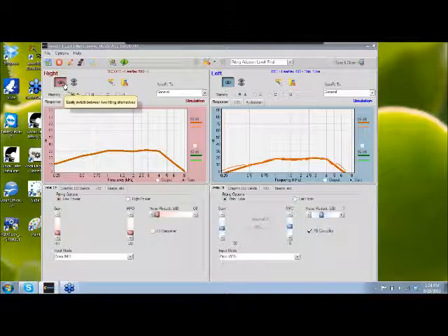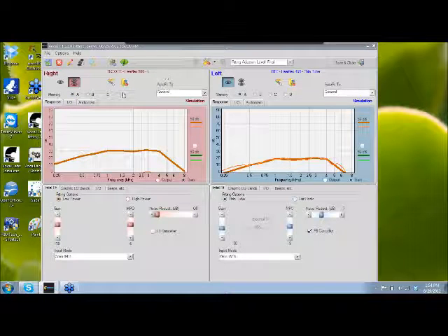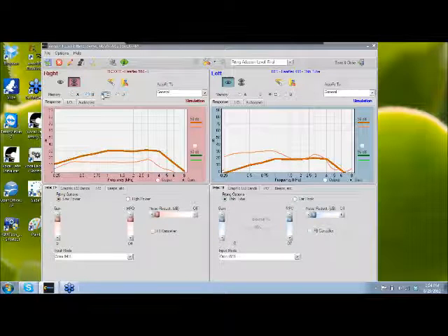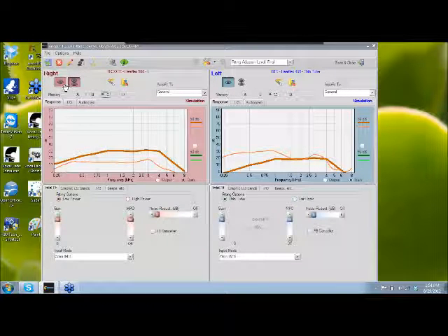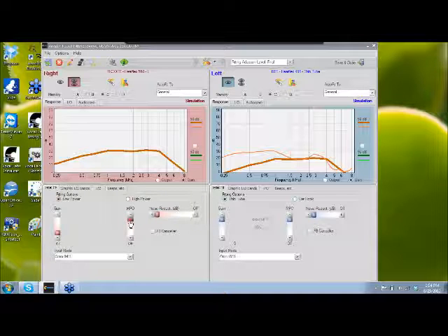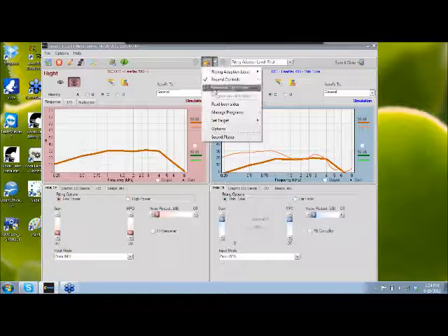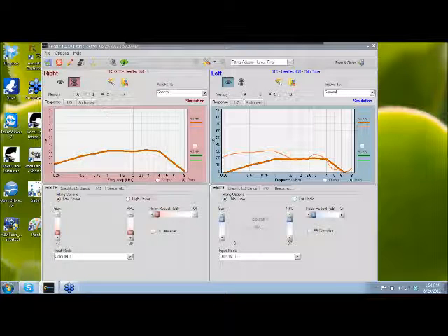And when you find the one that the patient prefers the most, when you load your program in, that is what's going to be loaded into whatever memory you're on. I could do the same thing with memory C. They copy the first time they copy. Then after that, I can make adjustments. Snap back and forth, and whichever one I decide to go up here and click program all valid sides, that is what's going to be loaded into the device.